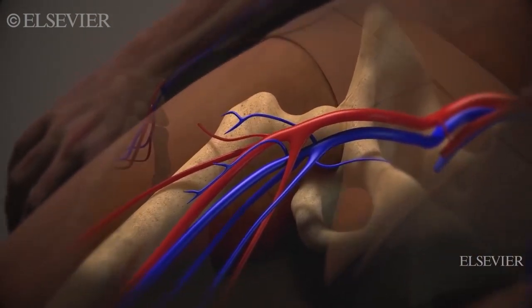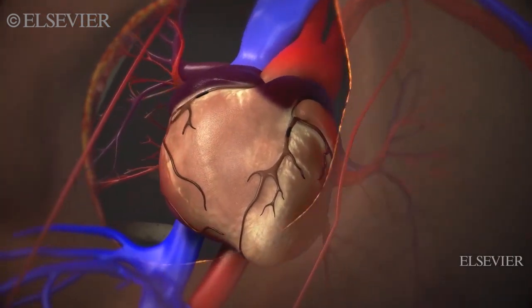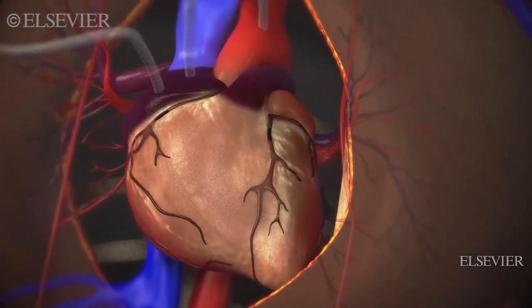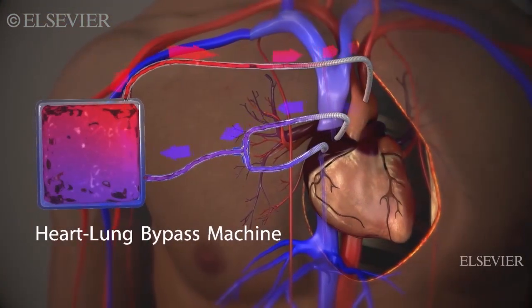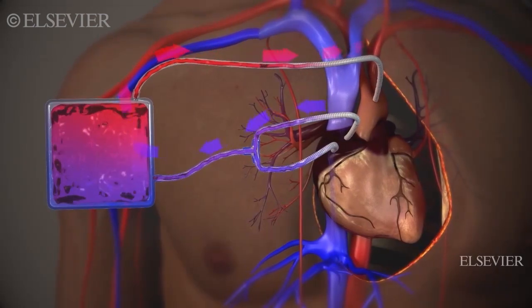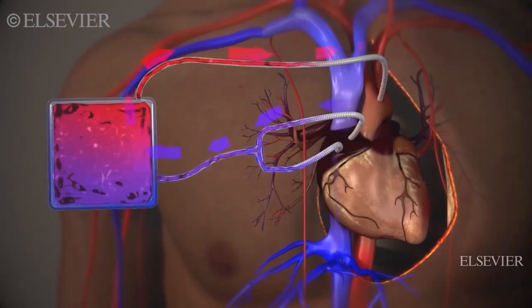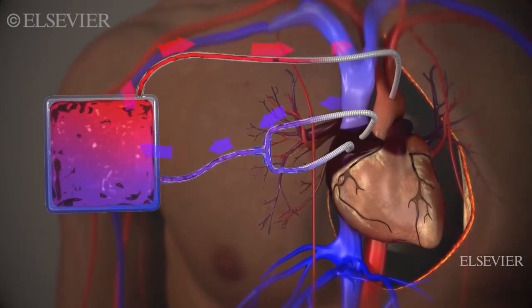Next, the heart is cooled to keep it still, using a heart-lung bypass machine, and is connected using plastic tubes. One tube carries blood from the body to the bypass machine, which supplies it with oxygen. The other tube pumps the oxygenated blood back to the body. In essence, the blood bypasses the heart and lungs to get to the rest of the body.